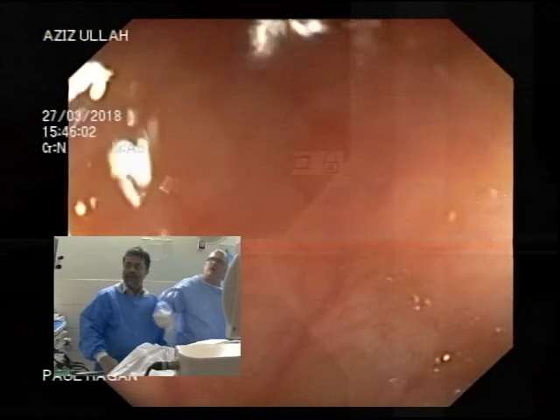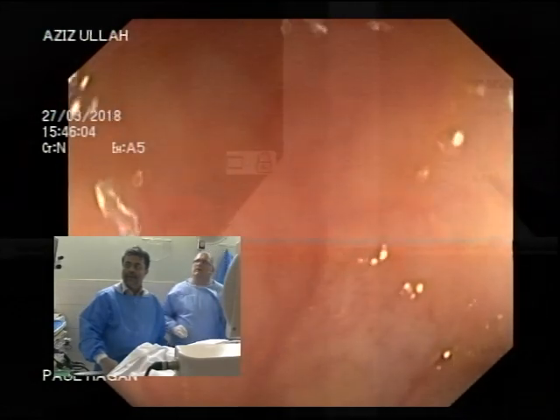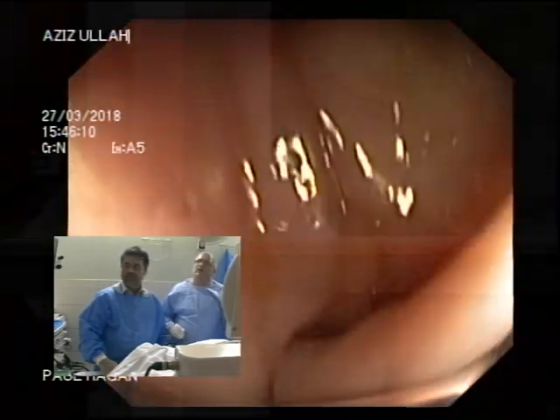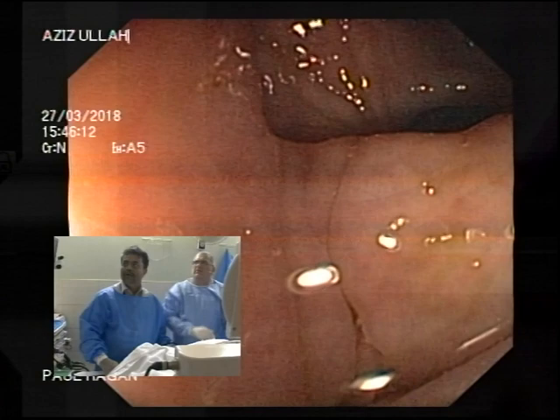Allow the scope to come this way. Allow it. Right. Now, tip up slowly. That's down. See them? And now let the clockwise torque slowly come in. Slowly. Tip up. Keep that tip up.